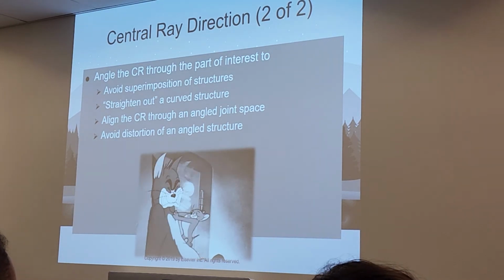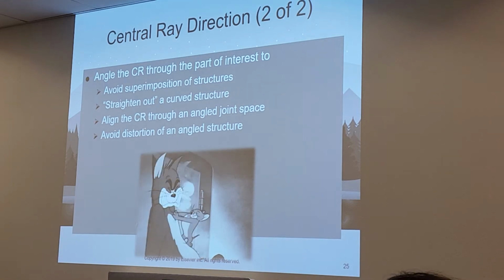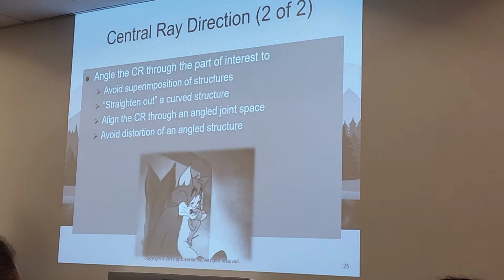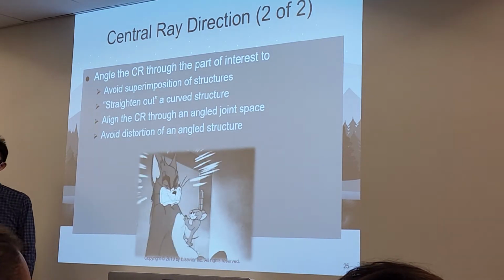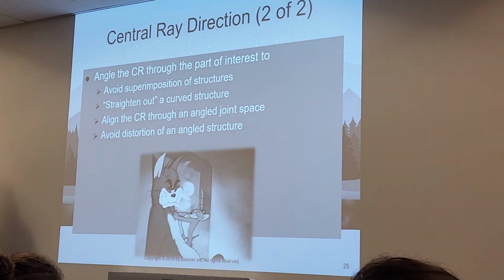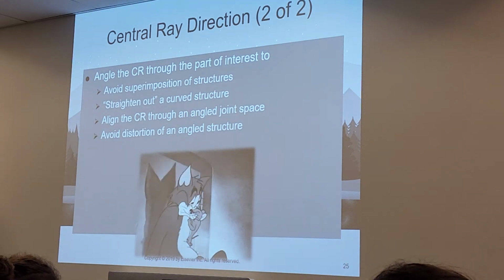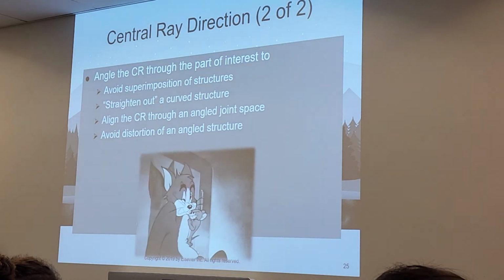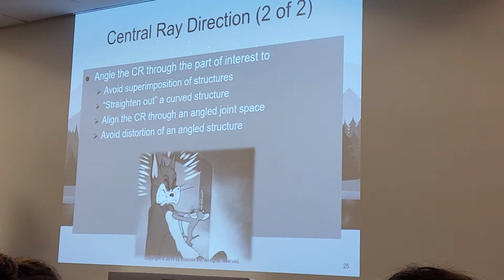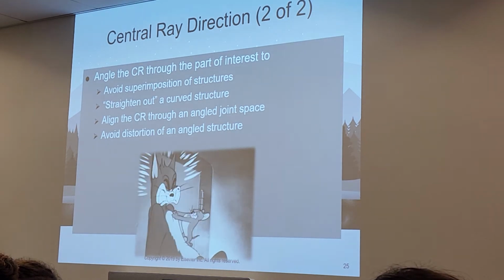So when we say angle, we are talking about the patient, or it could be both. So angle the patient or angle the ray? Normally with the patient, we do not angle the patient. The only thing we can do is rotate the patient. We can turn them one way, turn them the other way. Right? With the tube, what we are mainly going to do is angle. Remember, angle is that black button on the tube.